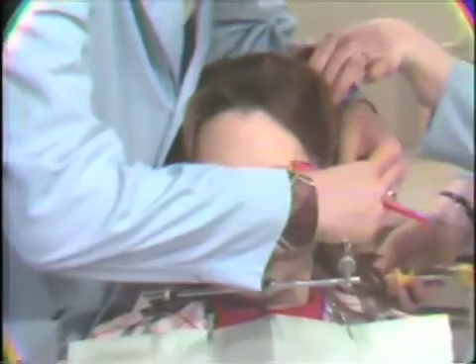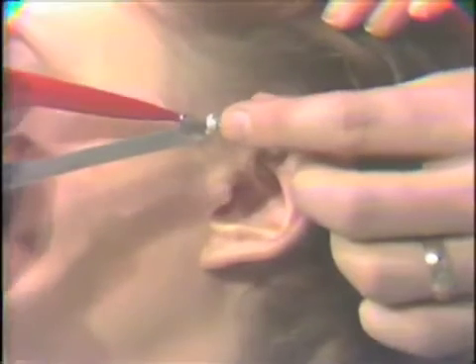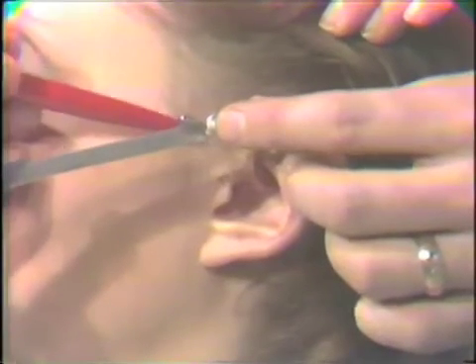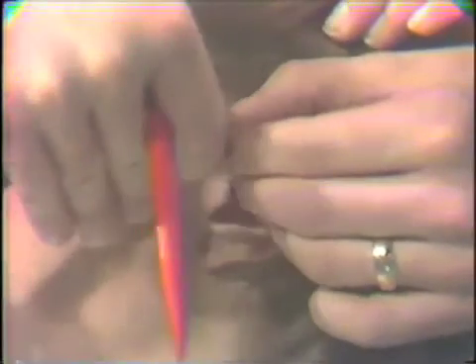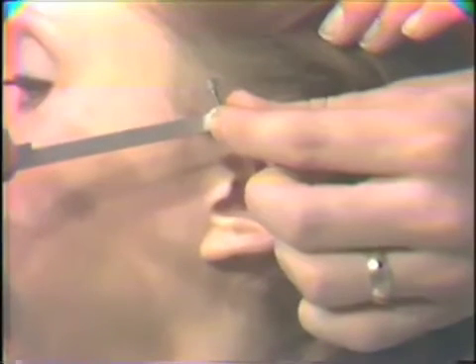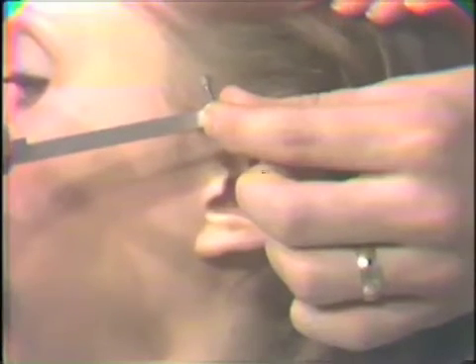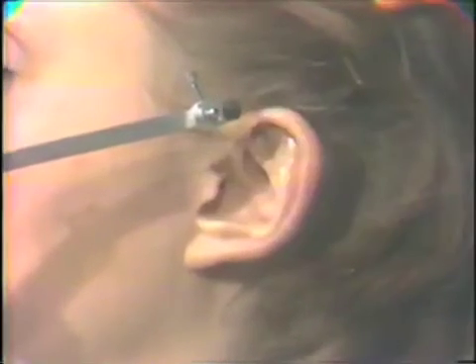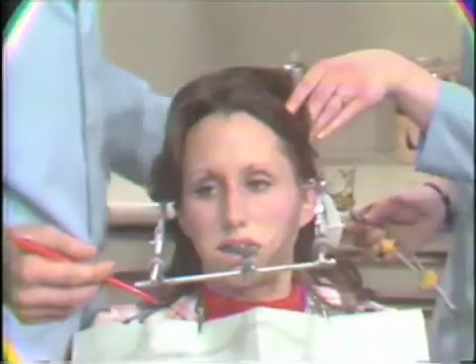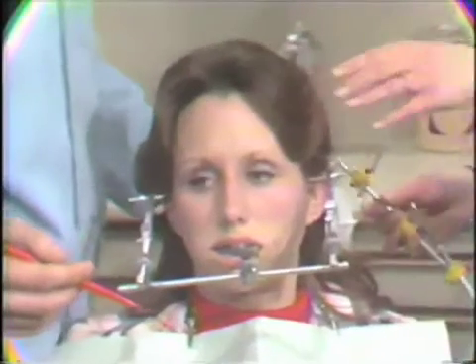We loosen the posterior stylus. Just put a small mark on the end of the stylus. And we can move this in to touch the skin and make our mark. Now, from this initial mark, we can go ahead and with our tattooing equipment, make our permanent mark. And this procedure is now repeated for the other side.